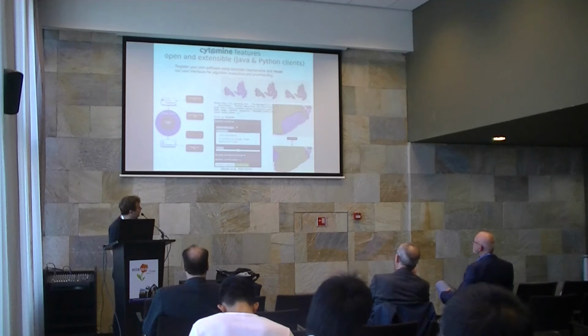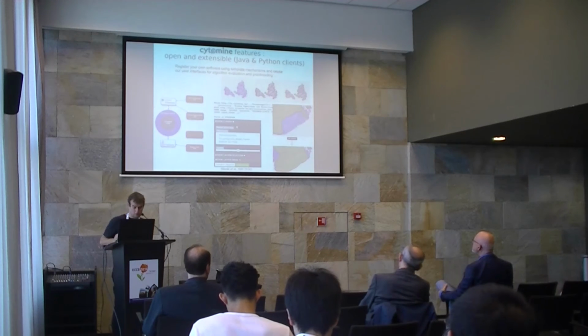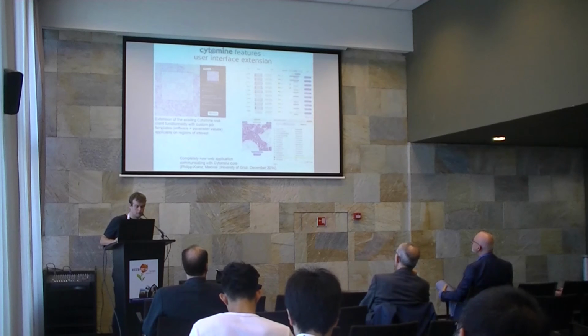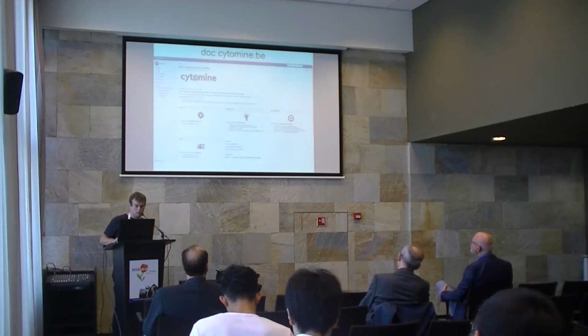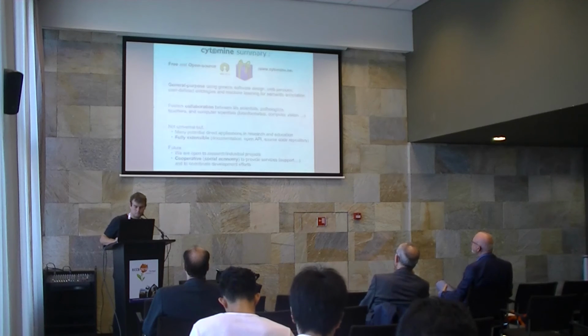You can select your algorithm, you can visualize the segmentation mask that has been produced by this algorithm, and you can use our proofreading interface so that you can correct this segmentation mask. It's the same for the user interface, you can extend it easily. I will skip this. The software is fully documented, and we have applied it to a large range of problems in lung cancer, breast cancer, thyroid and cervical cytology, renal biopsies, etc.